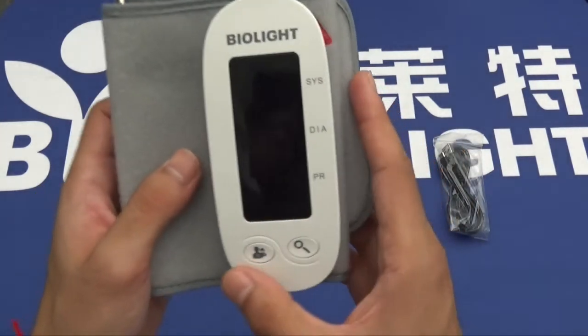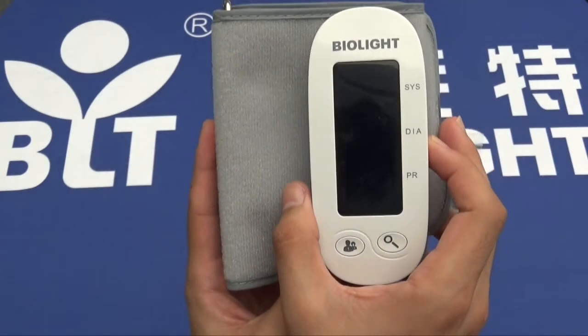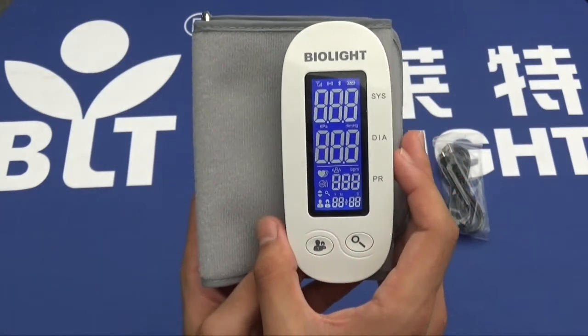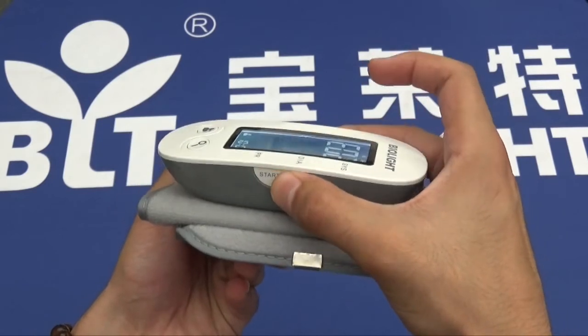If we look at the device itself, you can see that it's a very simple design, easy to use. There's a start/stop button, which I will press once to activate the device. Upon activation, it will immediately start recording data, as you can see. It's intended for use on the upper arm, so I'll press stop.